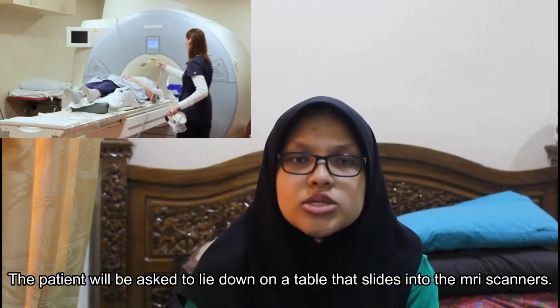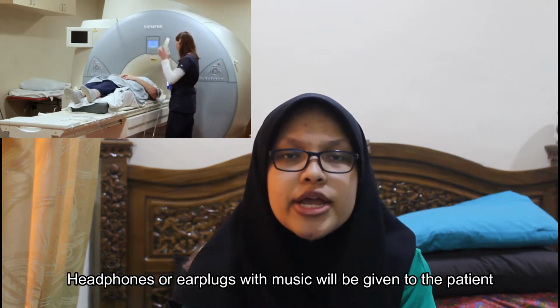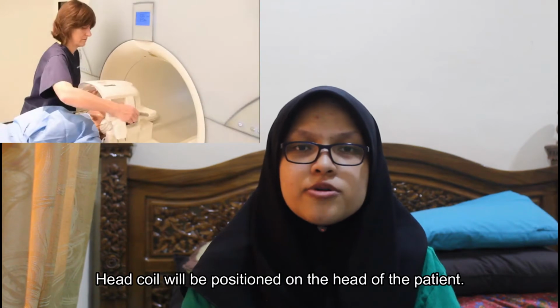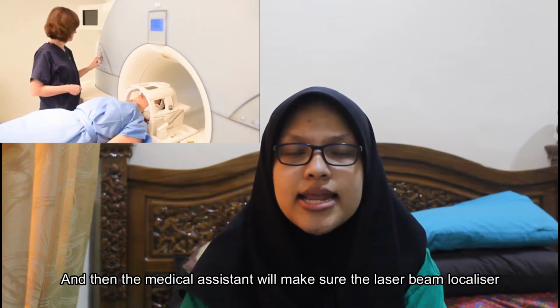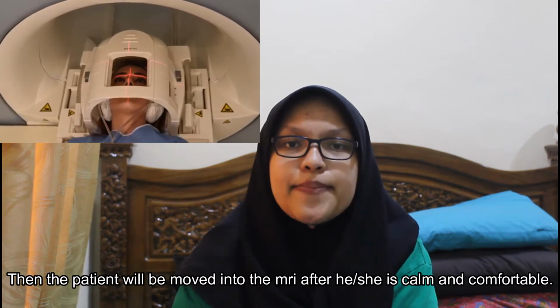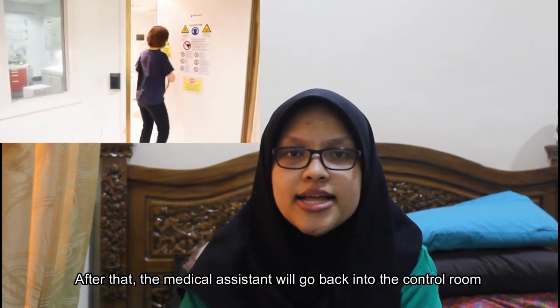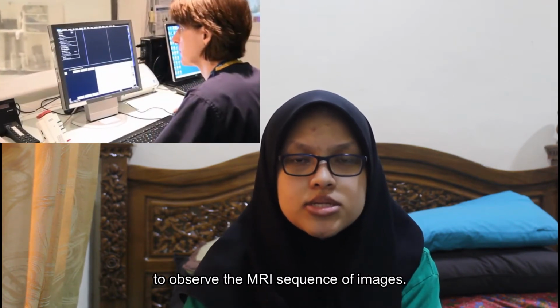The patient will be asked to lie down on a table that will slide into the MRI scanner. Headphones or earplugs with music will be given to the patient as the MRI scan makes loud noises. A head coil will be positioned on the head of the patient, and then the medical assistant will make sure that the laser beam localizer is centered on the glabella. Then the patient will be moved into the MRI scanner after he or she is calm and comfortable. After that, the medical assistant will go back to the control room to observe the MRI sequences of images.